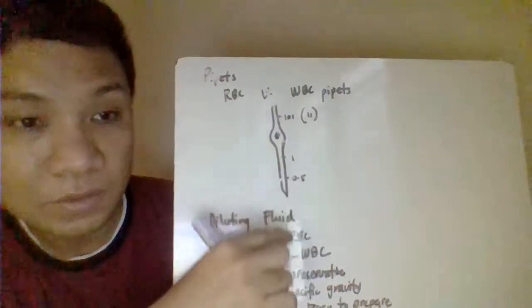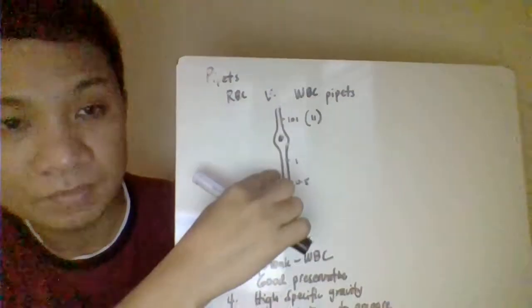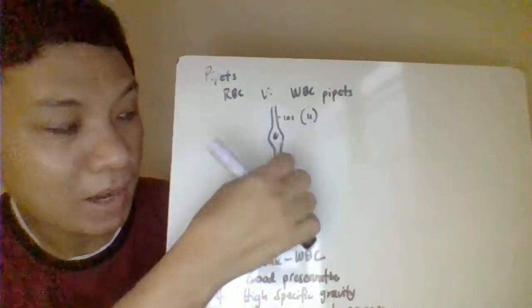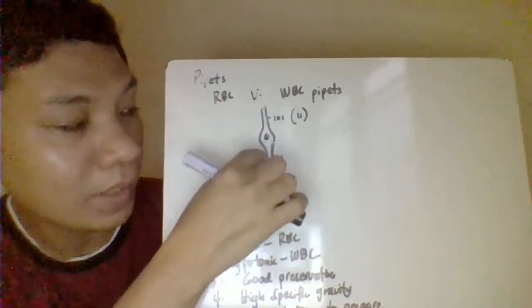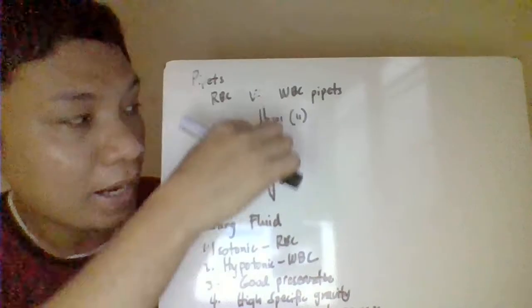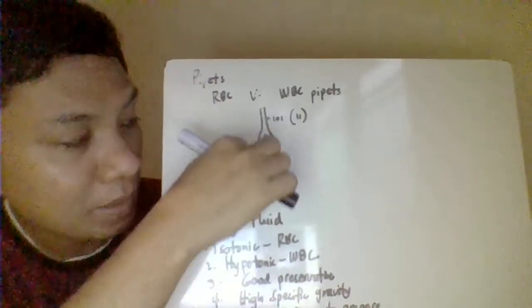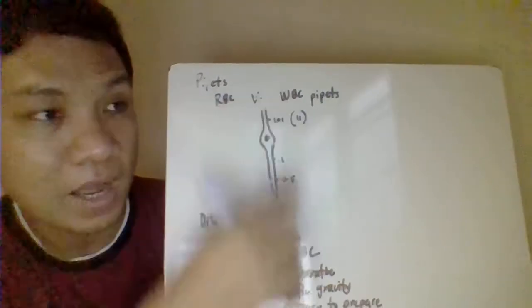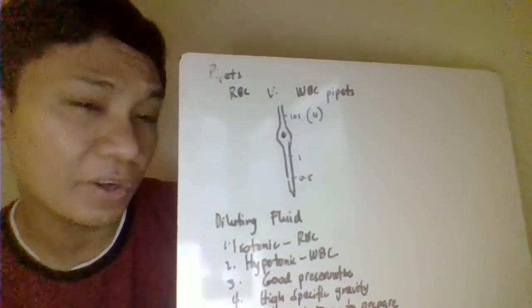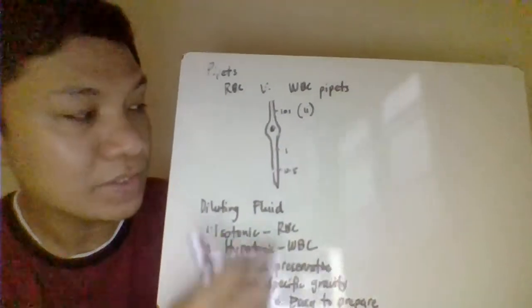Okay, you allow that one to dispense here few drops of the blood kasi ang mga dito na part, baka diluting fluid lang dito. Diba kanina nag-aspirate ka ng diluting fluid? So, baka dito na part ay diluting fluid, walang blood. So, para bumaba ito ang ating na mix na blood, papunta dito, so magdi-dispense ka ng few drops of the blood. Pwede mo siya i-dispense sa cotton or even in your tissue paper. After you have dispensed already, so ita-charge mo na siya.